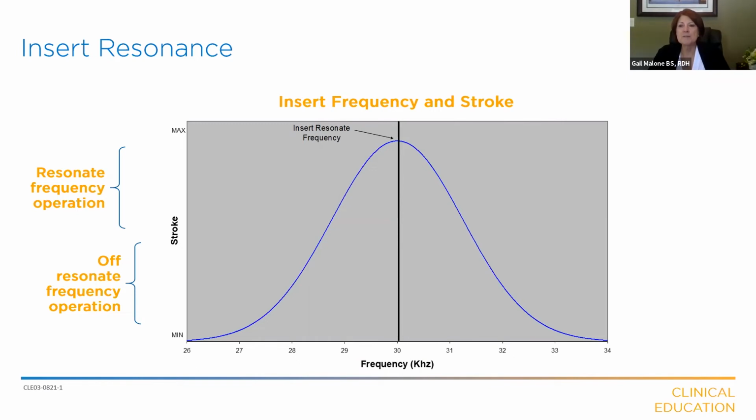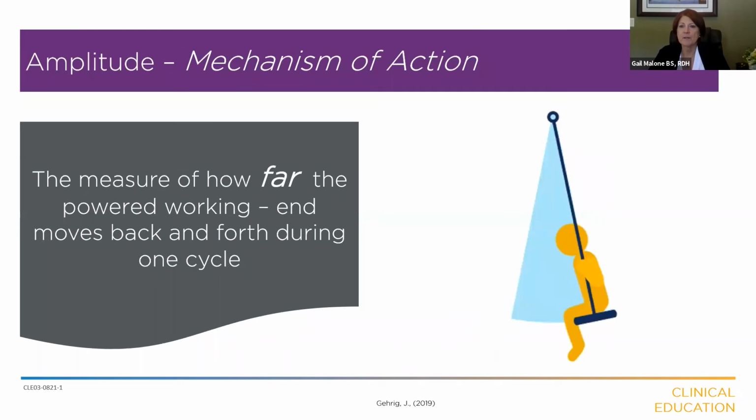And this really speaks to the importance of using inserts and units that were designed to work together as a system. In other words, harmonious systems. Inserts and units from the same manufacturer will deliver the best performance. So we want to focus on keeping our systems harmonious, meaning don't mix your inserts from one manufacturer to units from another. It's going to have some sort of an impact on the actual performance of the inserts.